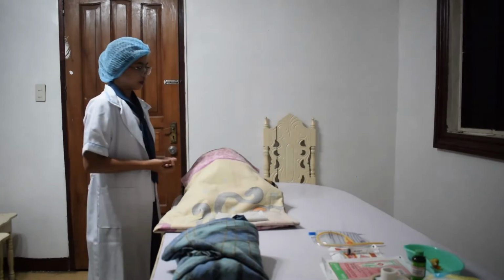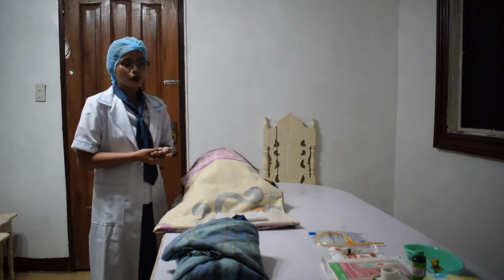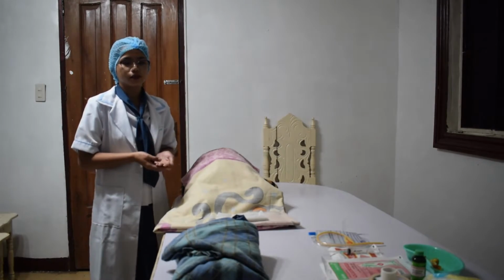So, our assessment: assess the client's overall condition, and determine if the client is able to cooperate. Determine when the client last voided or was last catheterized. Percuss the bladder to check for fullness or distension. Assess for redness, excoriation, skin breakdown, odor, pain, or discomfort. Assess for discharge, drainage, and any localized area of tenderness.